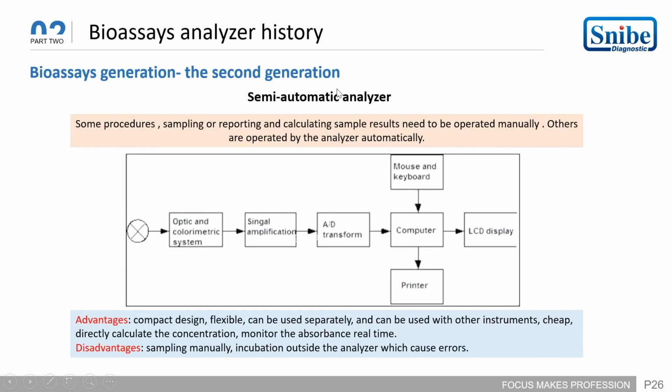The second generation, semi-automatic analyzer. Some procedures, sampling or reporting and calculating sample results need to be operated manually. Others are operated by the analyzer automatically.